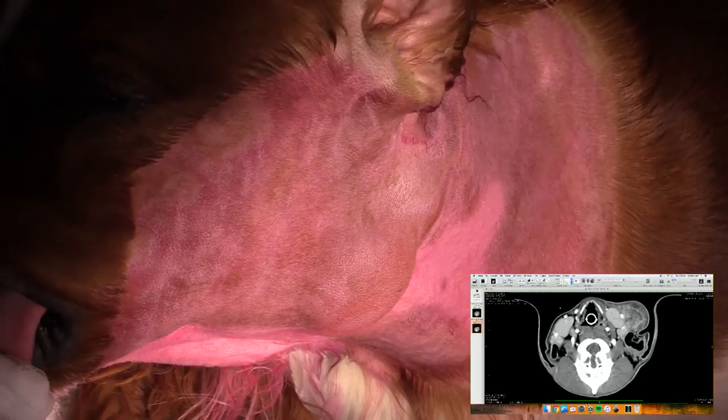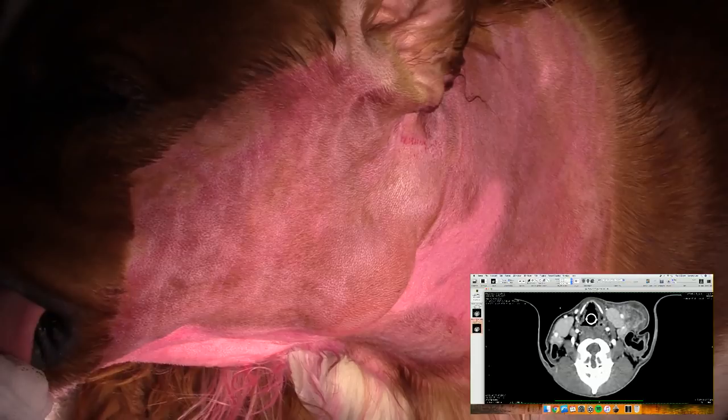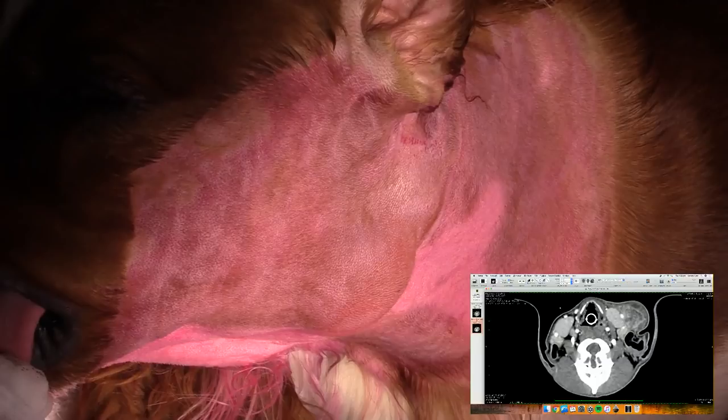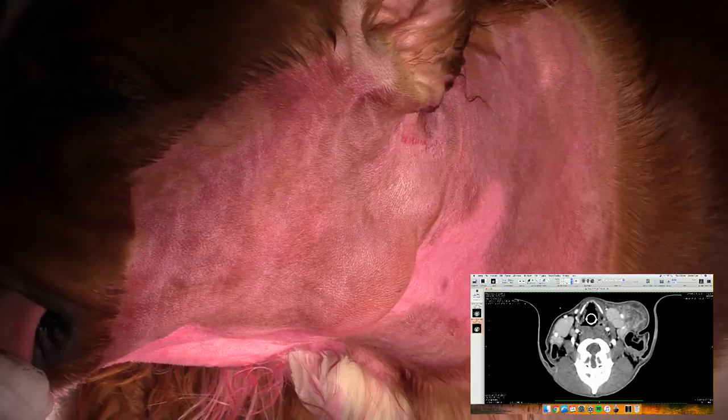So the white dots that we can see for the most part are blood vessels that have IV contrast in them, and I can't get to my computer right now, so I can't really point them out clearly, but pretty much all the white dots that you see around are blood vessels. There's one that's right deep to the mass, which is probably the jugular vein, or it might be the lingual-facial vein. And that is likely going to be sacrificed during this procedure. Sitting underneath that lingual-facial vein, just underneath the mass, is the mandibular salivary gland. You can see the paired one on the opposite side.